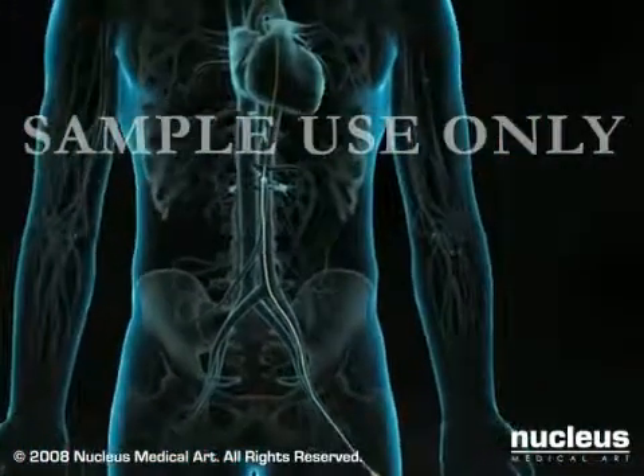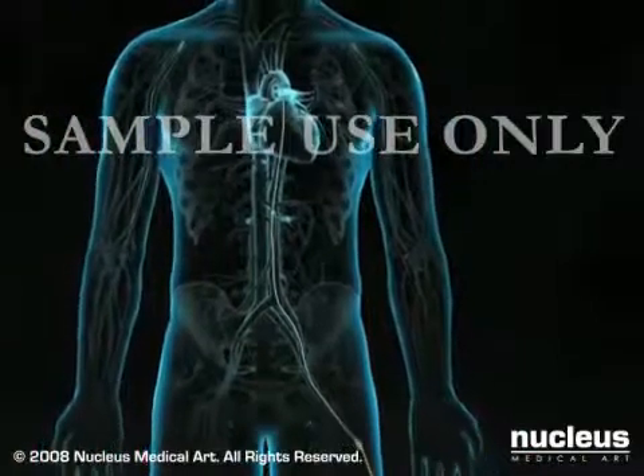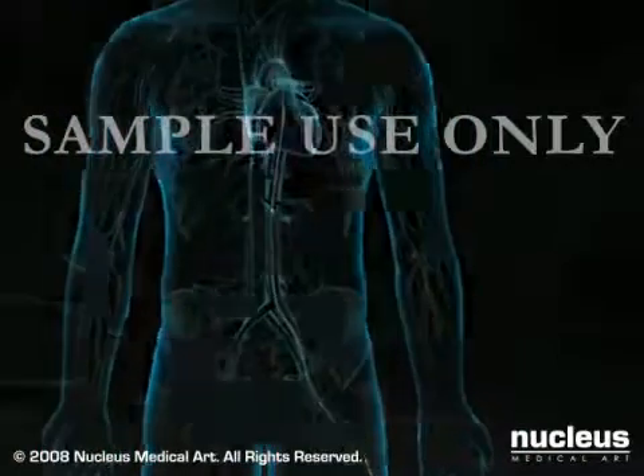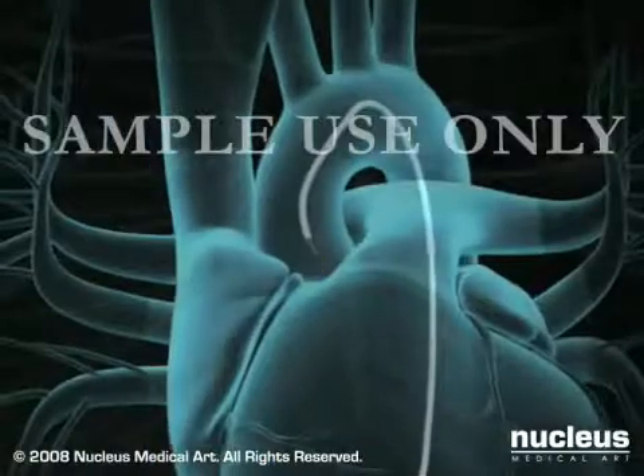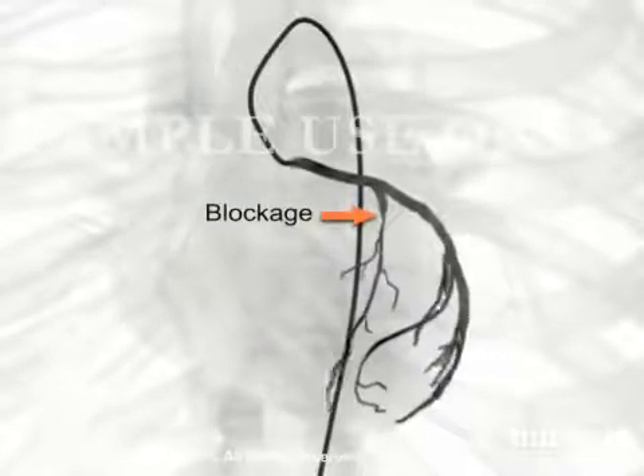You may feel pressure as the wire and sheath are inserted through the groin and pushed through the artery, but you will not feel their movement inside your arteries. At this point, your doctor will remove the guide wire, position the tip of the catheter just inside the coronary artery to be treated, and inject a special dye. The dye allows the fluoroscope to take X-ray images, called angiograms, of the artery's interior. Any blockages will be clearly identified as the arteries fill with the dye. You may feel flushed or slightly nauseated when the dye is injected.